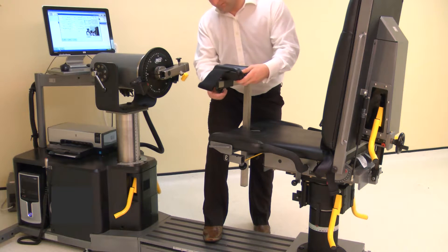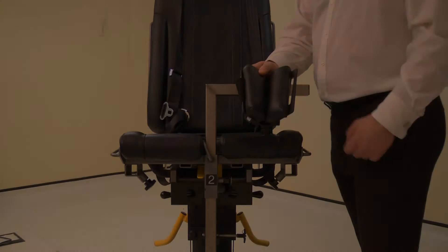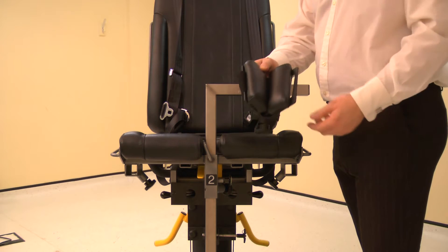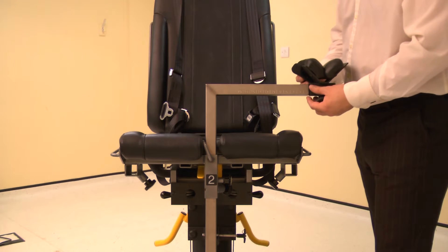Attach the forearm stabilizer V-pad to the stabilizer tube. Ensure the wide part of the pad is towards the chair. Then slide onto the stabilizer tube and secure with a screw.